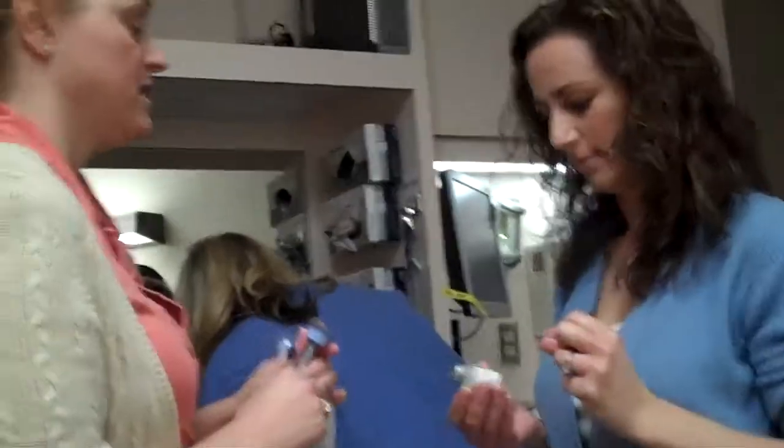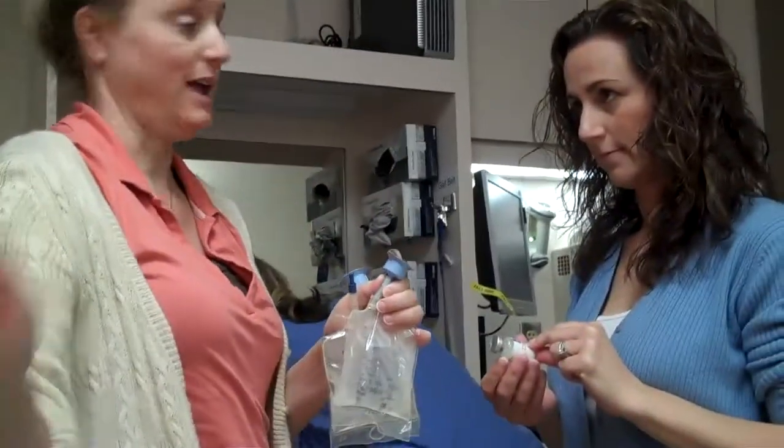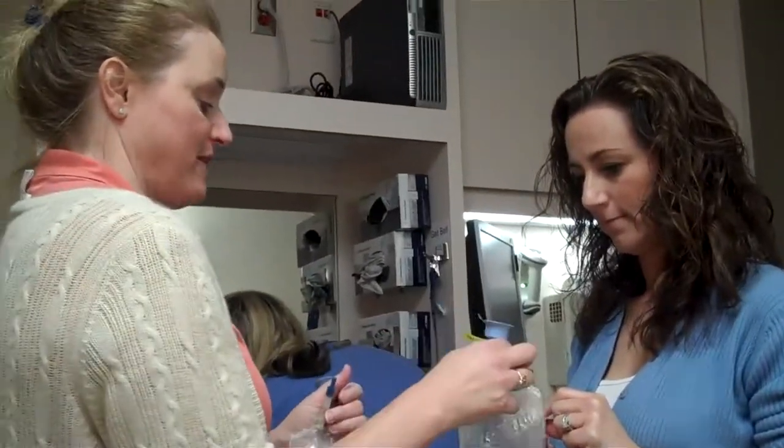Okay. 1,000 milligrams a day. Yes, right. So, 2 bottles, 2 bags per day. And then you're going to pull off this little silver thing. I'm going to have you do it.